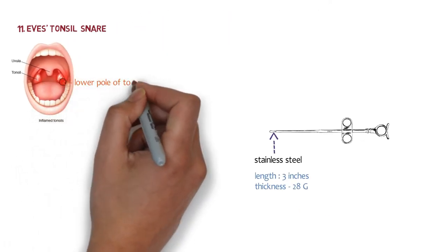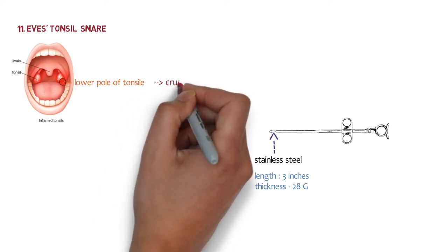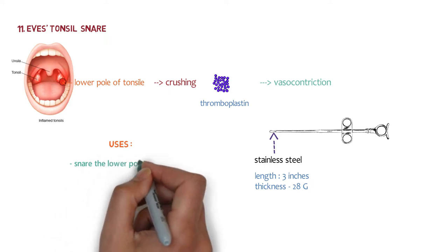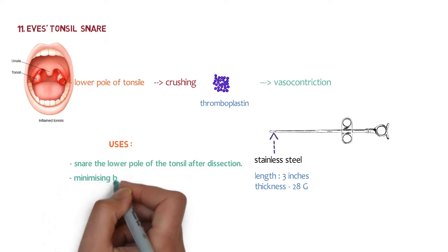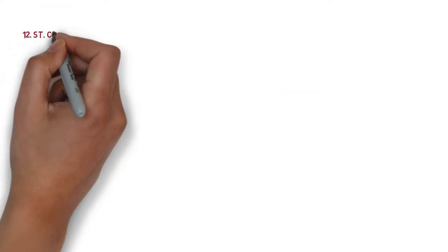The tonsil snare is used to snare the lower pole of the tonsil after dissection. The lower pole is crushed on snaring, and after crushing, thromboplastin is released. Thromboplastin is a powerful vasoconstrictor, so it minimizes bleeding. This is the key use of the tonsil snare.